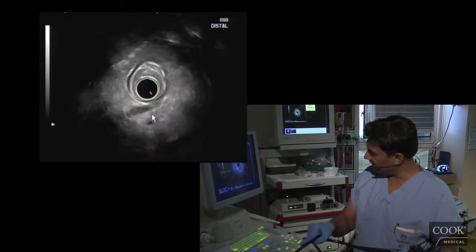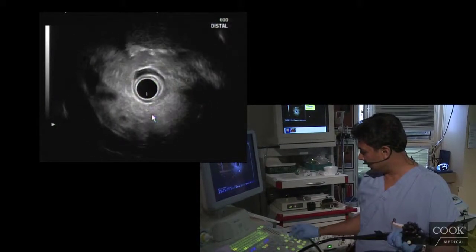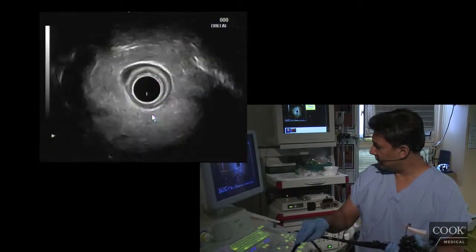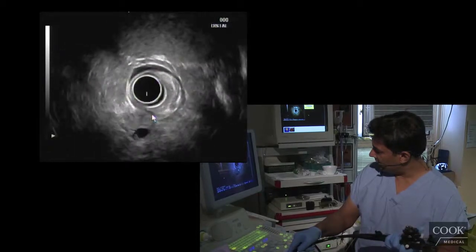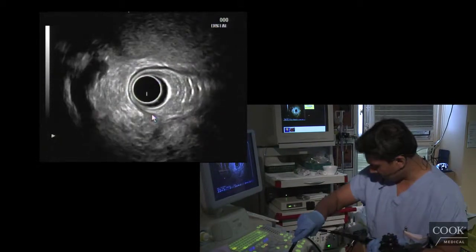So far that looks pretty good. I'm going to try and get a nice long view of his bile duct. Zoom in just a little bit. There's his PD as well. It's kind of an unstable position for his bile duct, but we're getting a good view there. And it looks very good.